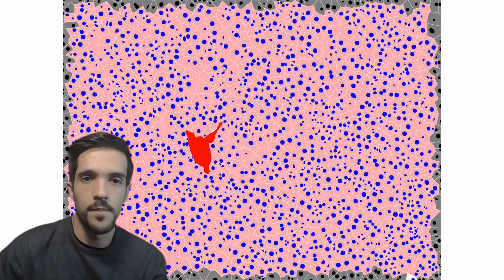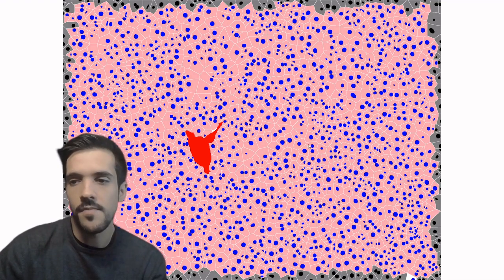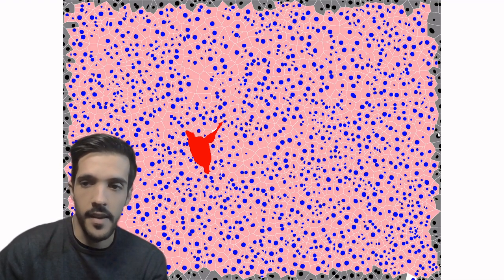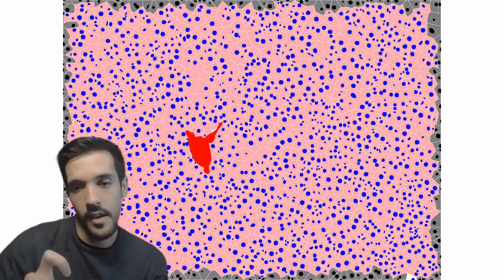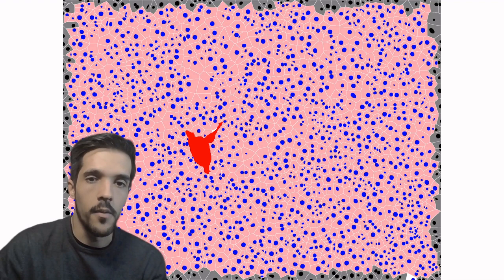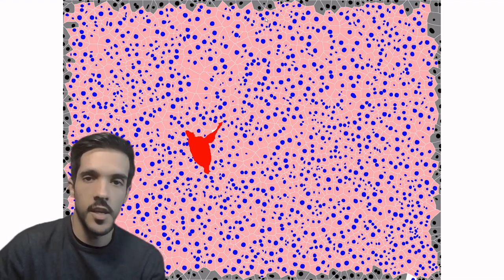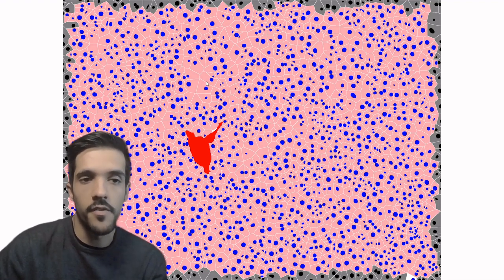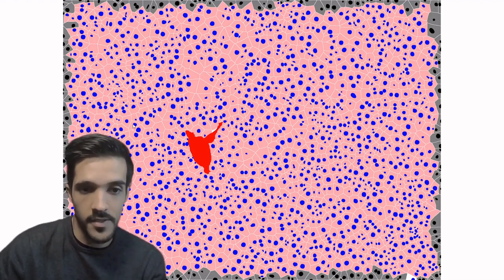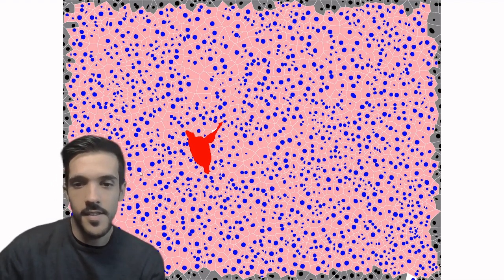The elements bordering the edge of the image are shown in gray and black, and in the final measurements they have a custom label to allow them to be excluded during the analysis, since both shape and size might differ a lot, as well as having more false positives and false negatives near the border. And that's it. This is the segmentation.